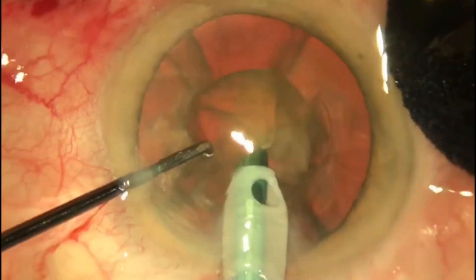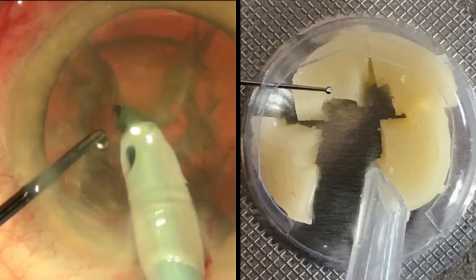Whilst we have not demonstrated nucleus removal, this still demonstrates the accurate placement of the bevel of the syringe engaging with the quadrant of the cheese disc.